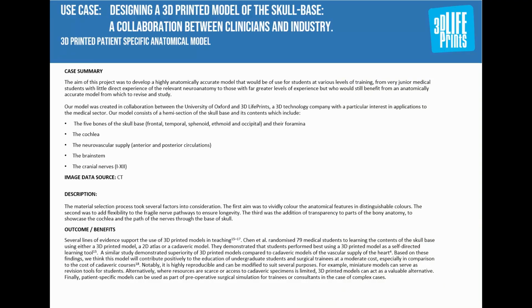Very much on a different scale of things. So I'll now move us over from pre-surgical assessment and planning to anatomical training. So one of our clients at 3D LifePrints is the University of Oxford, and especially their anatomy department. Their anatomy department has recently engaged on a very advanced task to update their teaching curriculum.